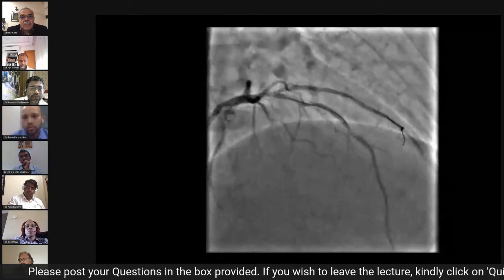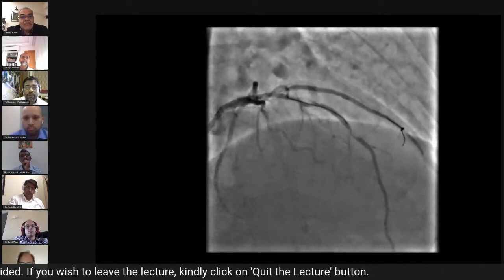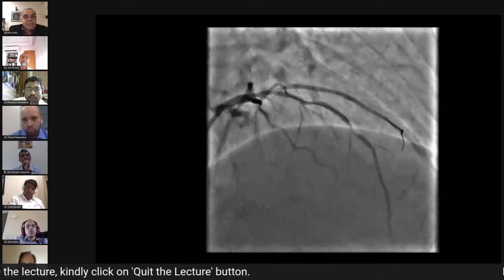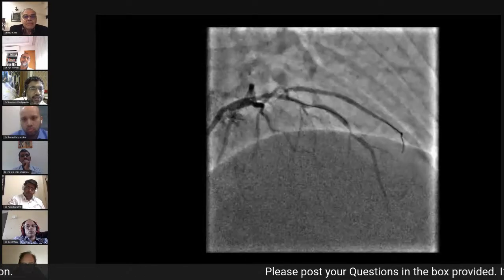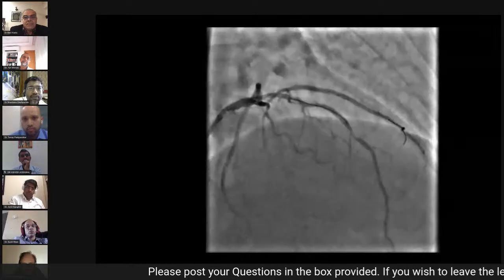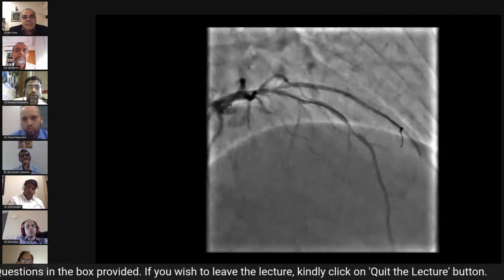Tanay, can you stop here? Can you stop for a minute? So basically, there is a diagonal disease at ostium and a lesion in the LAD beyond the diagonal, right? Yes, sir. So I just want to ask Dr. Kalra, how do you approach?